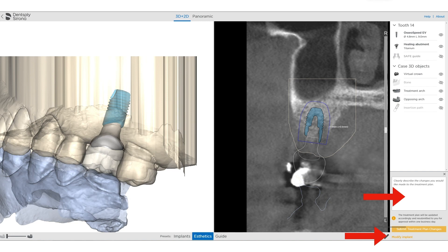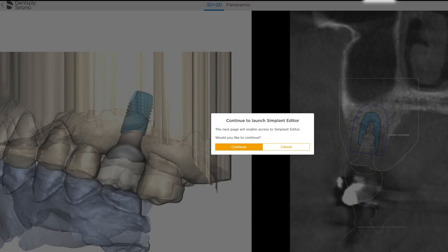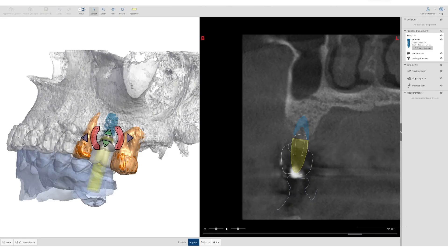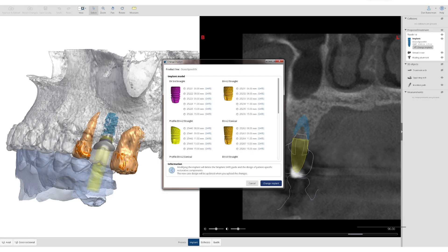If you want to make a change yourself, you have that option as well. Clicking that will open the Simplant editor software, which will need to be installed beforehand. Once the editor opens, it's quite intuitive to move the implant in any position and space you like. Keep in mind again with an EV that you will drill about a millimeter longer than the final apical position. You can also select a different size or diameter of implant. Once you make those changes, understand that it'll be about 24 hours before you get a new restorative plan — the restoration and guide will need to be redesigned and re-planned based on the new implant position.